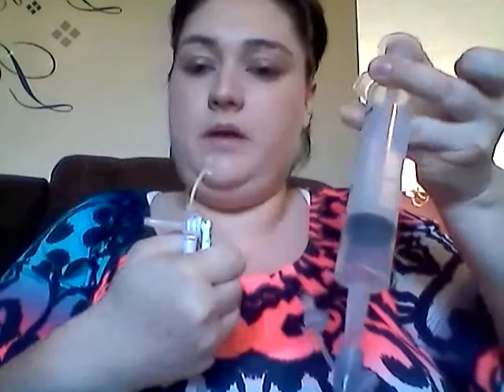So whenever you feed them, this is the only kind that we really like to use because we can do his meds in this port while we do his feeding in this port. So you're just going to put his meds in here with a 60cc syringe. I have one of those right here. And you're just going to take the lid off of this, pull up the food. You've got this attached. So then you're going to place it into this port and you're going to feed them. And it's just going to come out right here, and it goes into their stomach. So that's how his feeding tubes work.